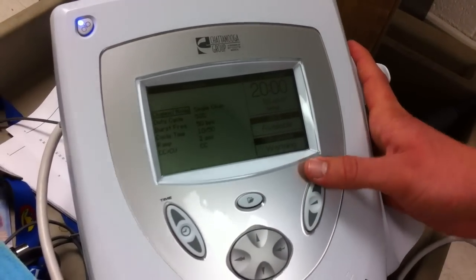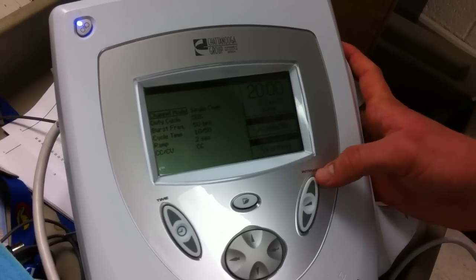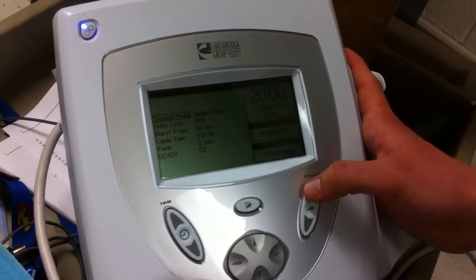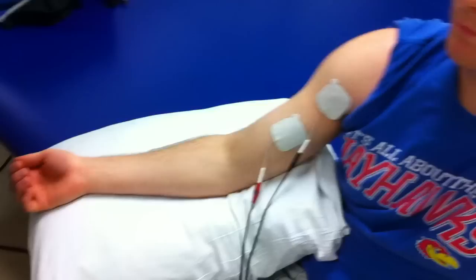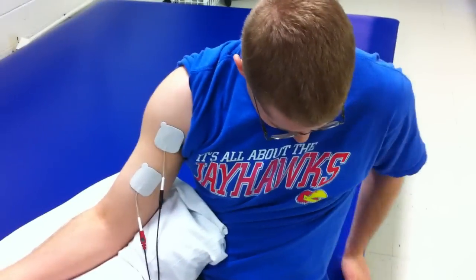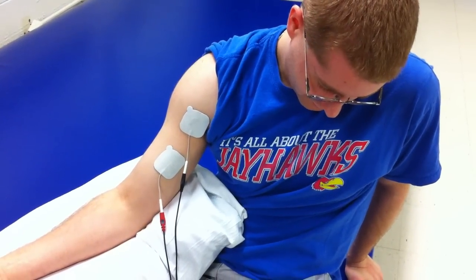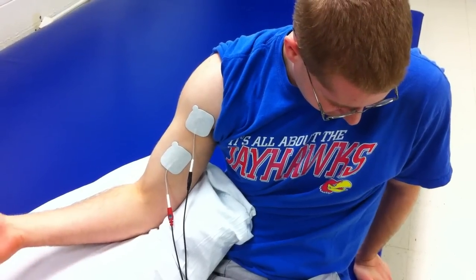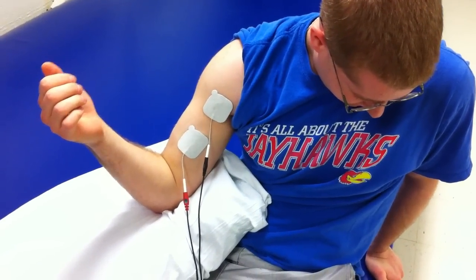I'm going to turn up the intensity until he feels a sensation and then gets an actual muscle contraction so that we can strengthen that biceps brachii. I'll go ahead and do that and you guys can observe. Now that I have that, I'll start the treatment.